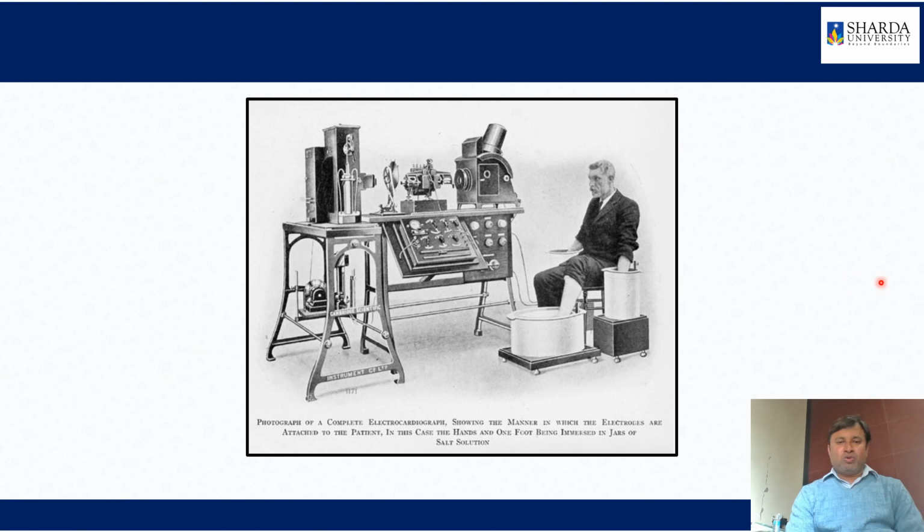And this is a very old ECG which was discovered early, and now it is totally different. It has totally changed since that time.